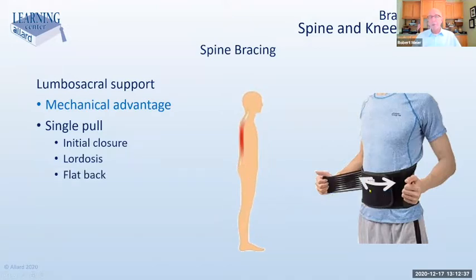If we're dealing with a person with a very flat back, then we tend to put these straps up very high on the front piece of this back brace. And that will help induce just a little bit of a curve into that spine. And that usually relieves some pain and makes the spine a little bit more functional. So with the same brace, you can address both an excessive curve or a lack of a curve in the lumbar area, just on how you place these elastic straps.